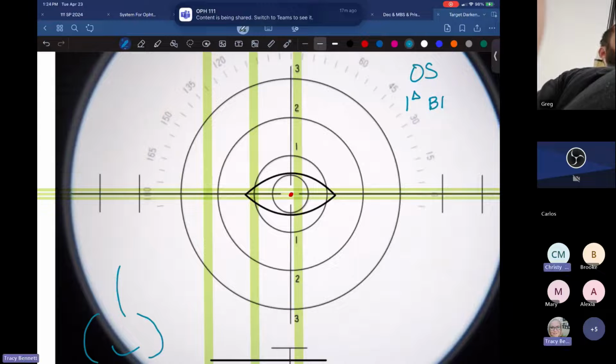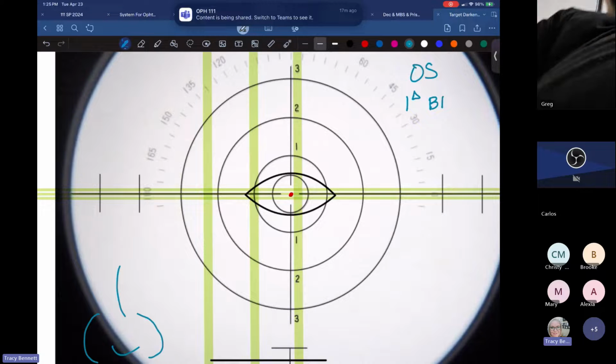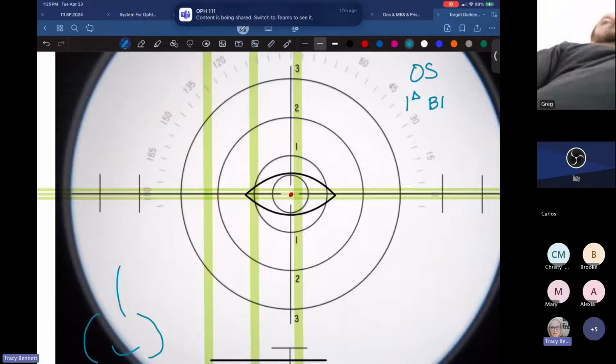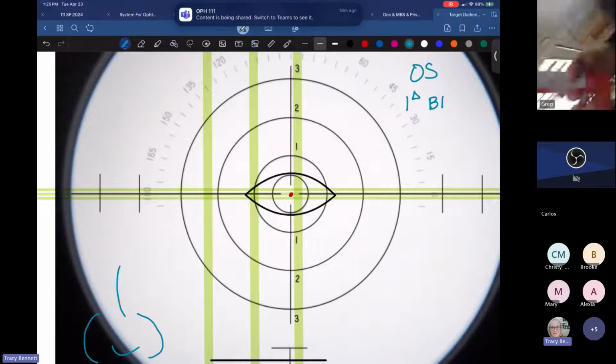The only part that impacts you is how you actually end up moving the lens, whether to the right or to the left, but you're going to be looking in the lensometer. So you're going to just watch whatever the target is doing, because that's what you care about. That's where it's just easy.